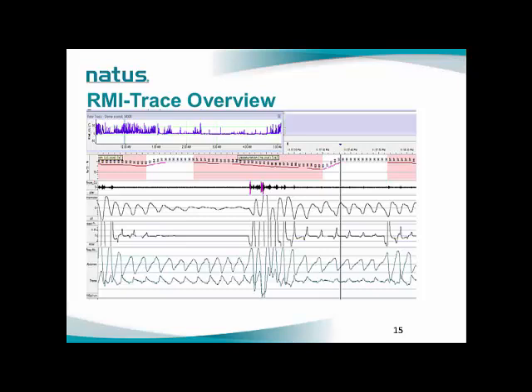The blue vertical bar represents the current time on the worksheet, where we have the SpO2, snore, thermistor, and thoracoabdominal traces. Looking at the thermal signal, it's evident that there are no apneas. Looking at the nasal pressure, it's obvious that there are hypopneas. Thoracoabdominal effort shows a desynchronized breathing pattern, which gives an indication that these are obstructive hypopneas.